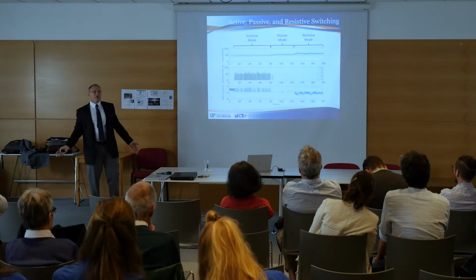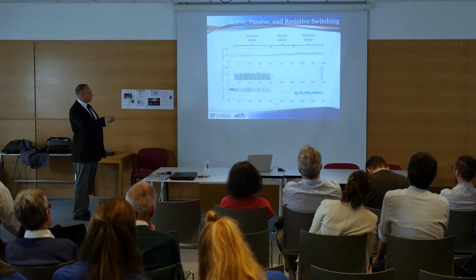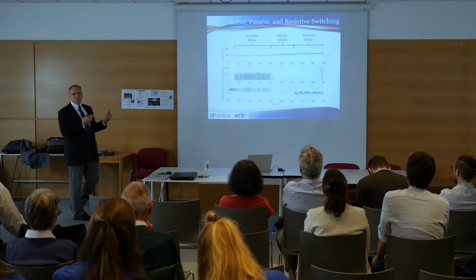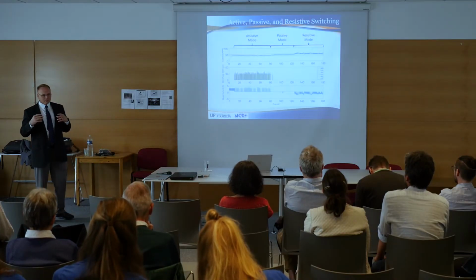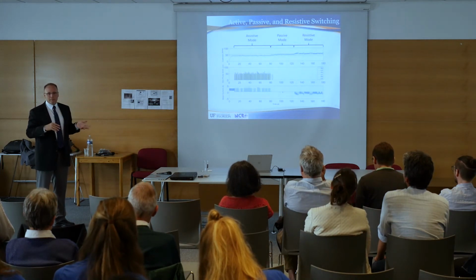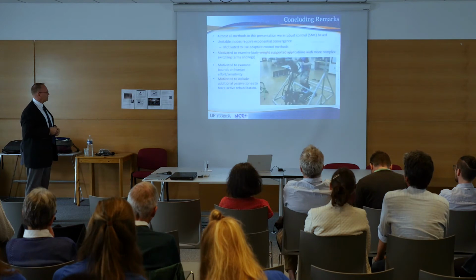And then we said, okay, now pedal really fast, and try to go beyond the threshold. You can see that the controller didn't allow them to go beyond the threshold very much, because the motor would cut on and start resisting them. What's cool about this is it's all automatic. Independent of anyone's capabilities, maybe they need all assistance or maybe very little, they can get on the cycle and the controller will automatically adjust, including not doing anything if they can keep it within a certain bound. So that was an interesting result.